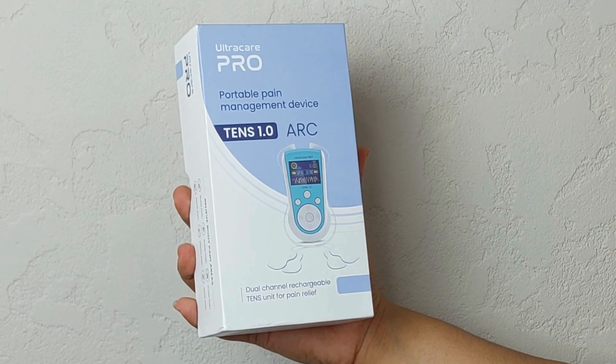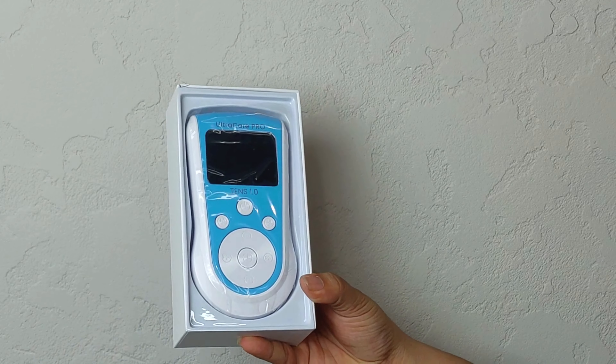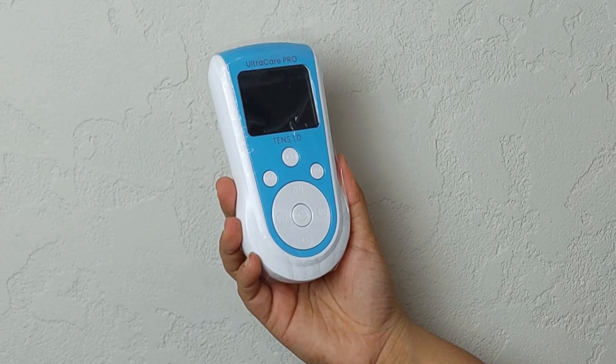Let's unbox the TENS 1.0 Arc, a dual channel rechargeable TENS unit designed to provide immediate relief from muscle and joint pain.